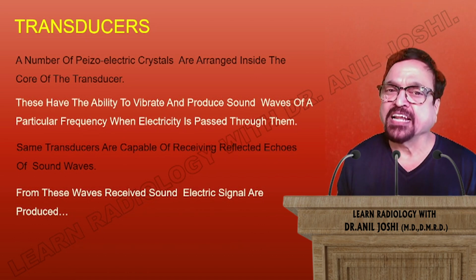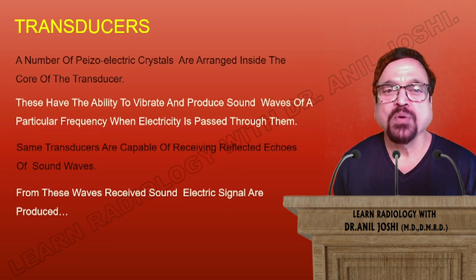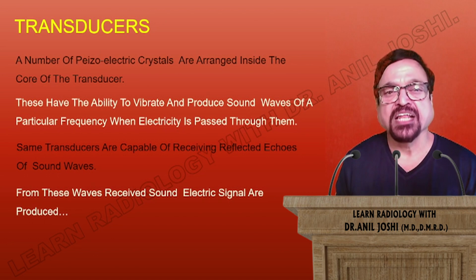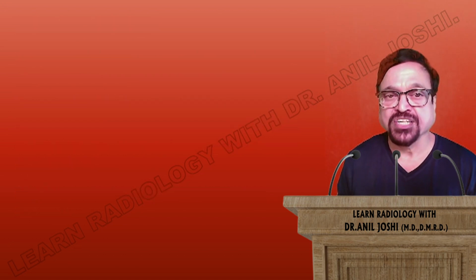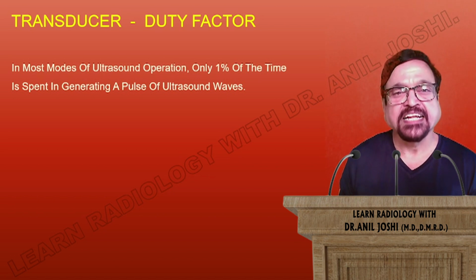Now let me make it a little bit simpler. The piezoelectric phenomenon is when electricity is applied to a crystal, it expands and contracts, or in other words, it vibrates. Due to this vibration, it produces an ultrasound. Once this ultrasound comes back, it hits the crystal again, and in this process it sets it into vibration again, where this sound energy is converted into electricity.